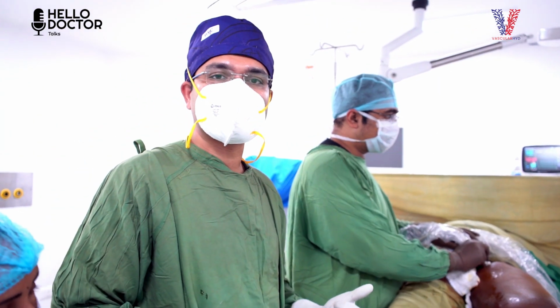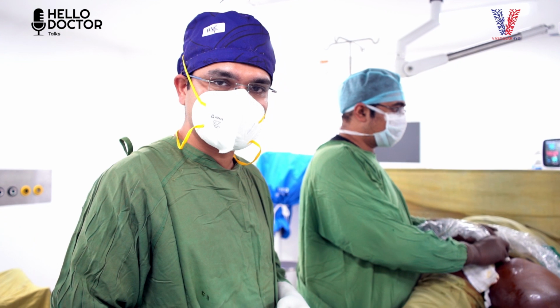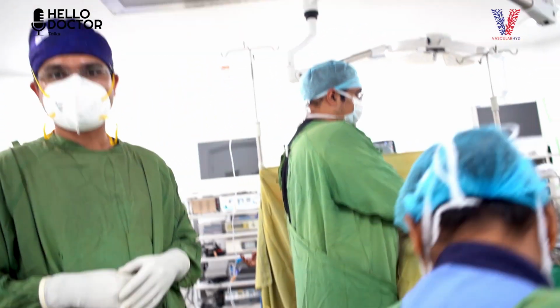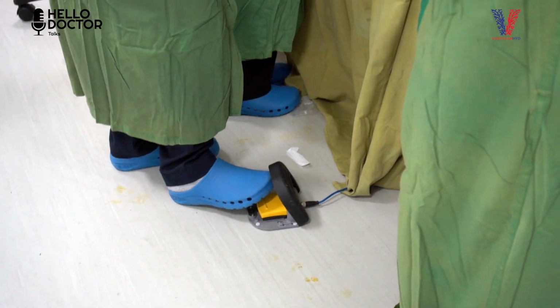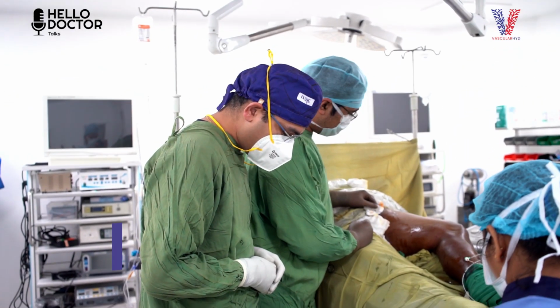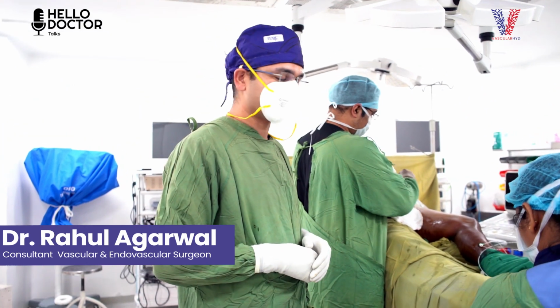So reconfirm the position of the fiber tip under ultrasound before you start the laser ablation, and we have the control of the laser ablation in the foot. So this is the foot pedal, the switch which will switch the laser on and off. This will be under the control of the person who is actually pulling the fiber out during the ablation.